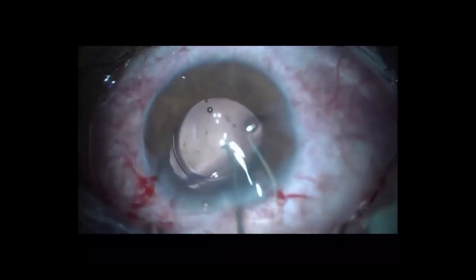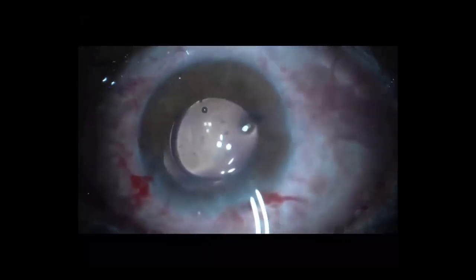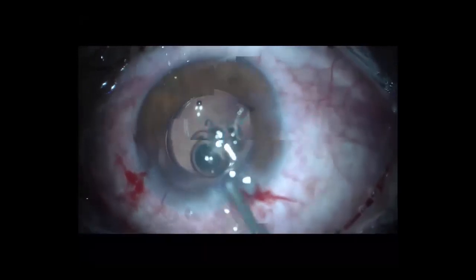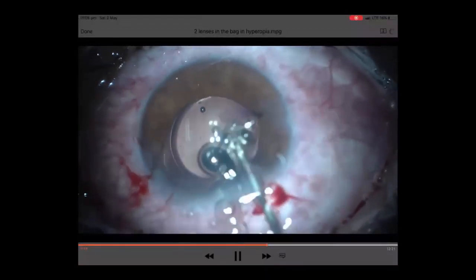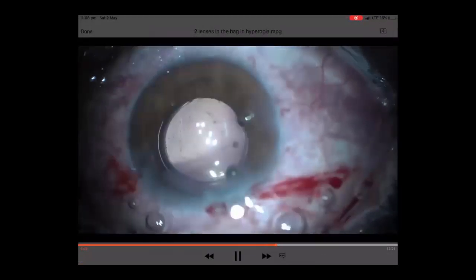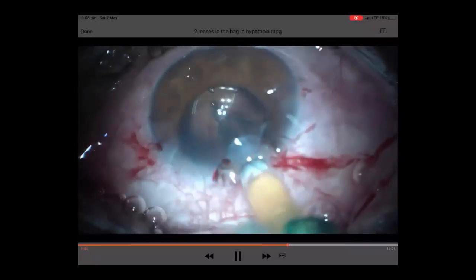It's a hydrophilic acrylic, this one? Yes. You prefer two hydrophilic? Yes, two hydrophilic acrylics. And then I use viscoelastic once again. And then we will put our second lens after we finish implanting the first one. This is the second lens coming now.